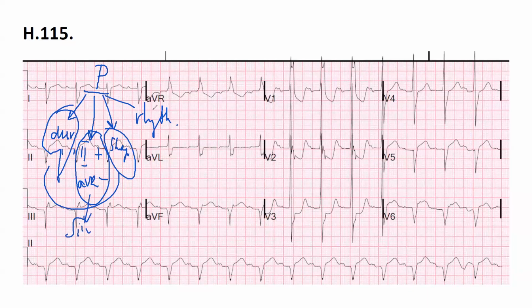Rhythmicity. If you do have P waves and the P comes regularly, that's a sinus. If it's not regular, for example, you have missing P waves, that can be two things. One, there is an impulse formation abnormality, for example, sinus arrest, okay? Or you can say that you have a sinoatrial block. Okay? This is what you can see. Next one.